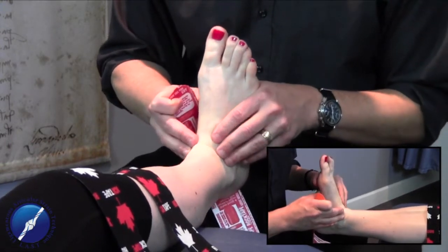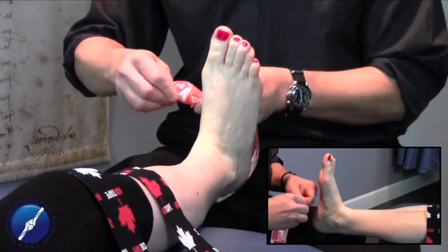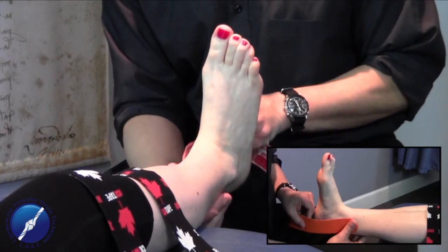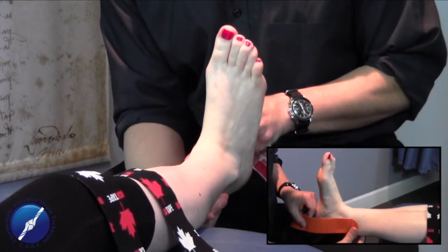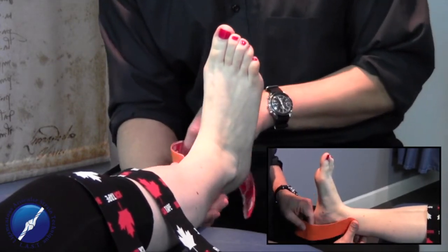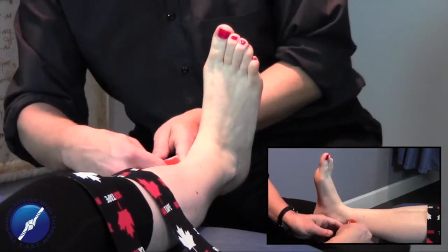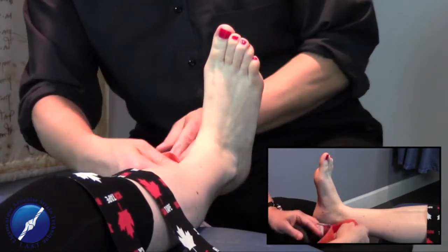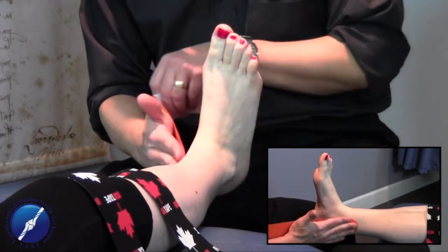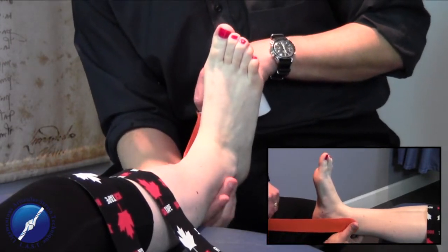To begin, we want to have our patient's foot in a neutral position. We peel off the end of the tape, come just superior to the medial malleolus, and tack the tape down onto her skin with no stretch. We pull the back of the tape off so that we have full access to all the tape, with no stretch at the tacked portion where we begin.